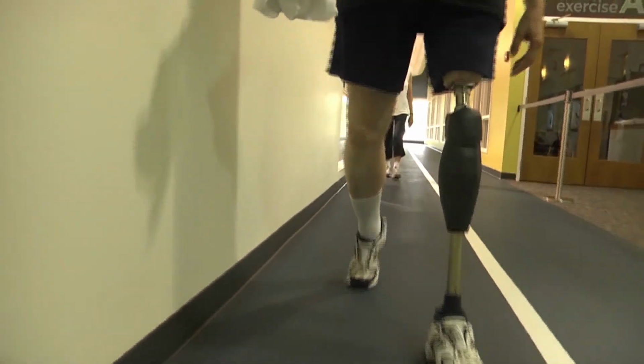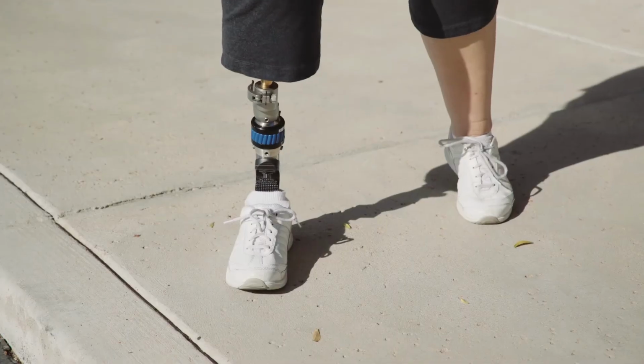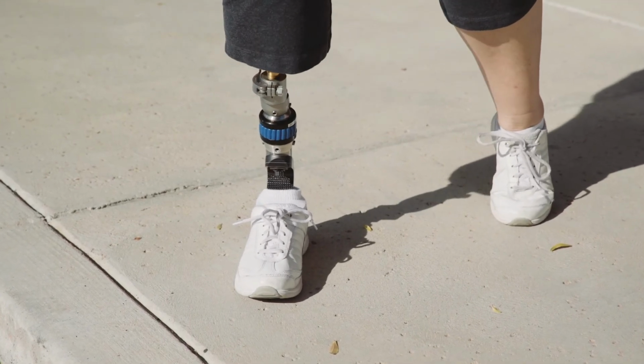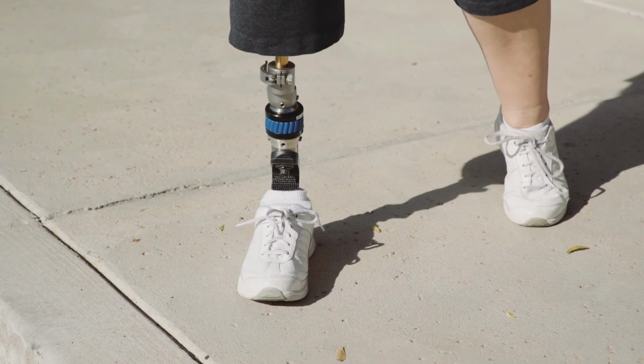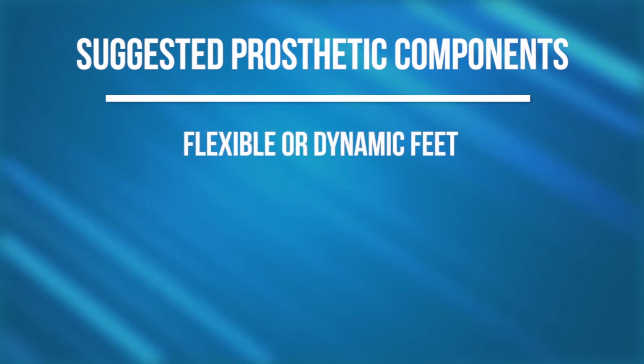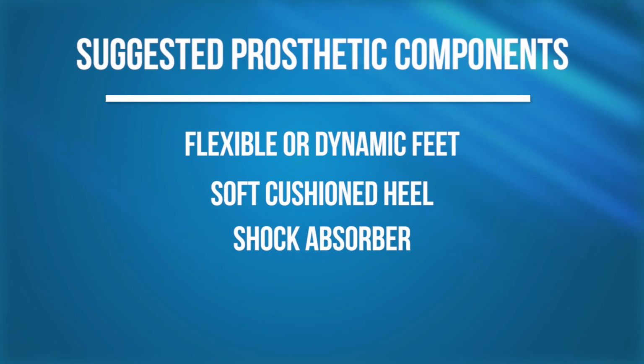Another difference is that there is a certain amount of play in every socket that helps reduce shear forces and torque on the knee and hip. With an osseointegrated patient, this absorption is also gone. For these 2 reasons, the components needed must provide good shock and good ground compliance. This can be achieved by any combination of the following components: flexible or dynamic feet, soft cushioned heel, shock absorber, or torsion adapter. Of course, it is possible to make a system too compliant, which would increase the energy expenditure of the patient, so care should be taken to find a good middle ground for each patient depending on their size, amputation level, and activity.